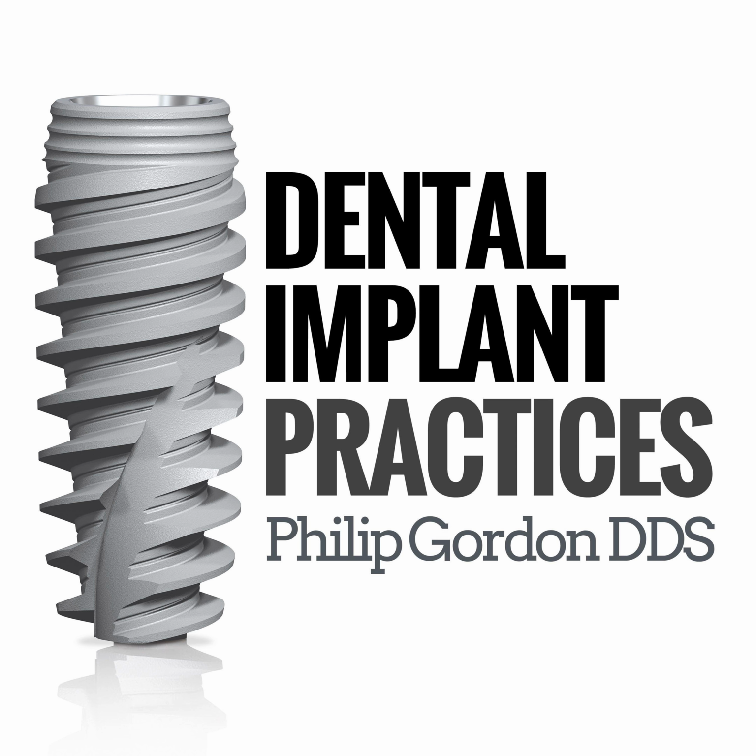Obviously, there needs to be bone for the implant to be placed, and that needs to be taken into consideration. Ideally, you want 2 millimeters of bone on the buccal and the lingual or facial when placing an implant for healing. Does the patient have any parafunctional habits? And is there enough inter-arch space to restore? So those are all things to think about.